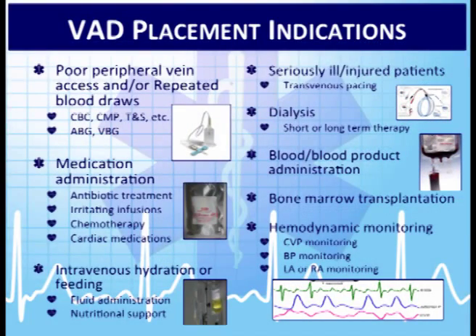Dialysis, it's best for people to get an AV fistula. A little bit more secure. However, while their AV fistula is forming, they may need to have dialysis during that time, that they may do it through a central line. So we'll talk about those.